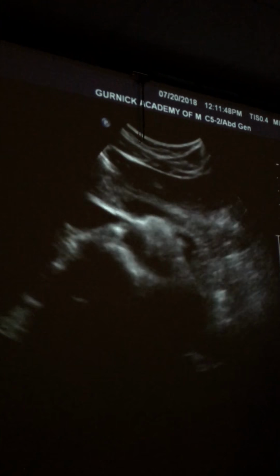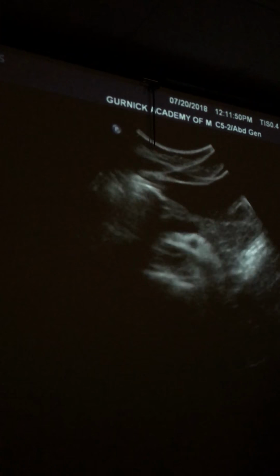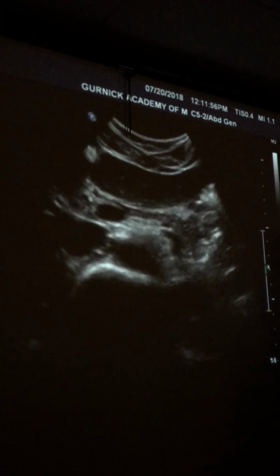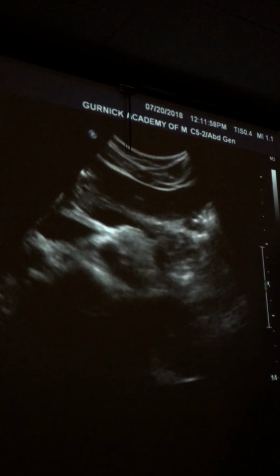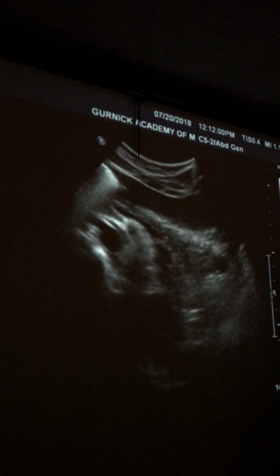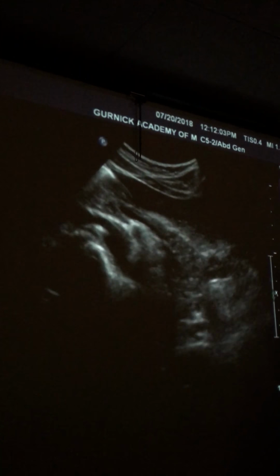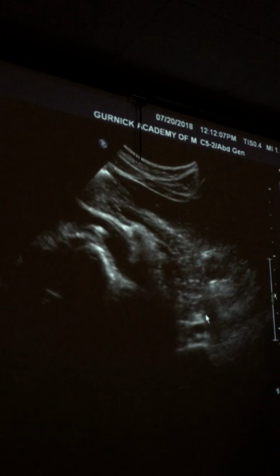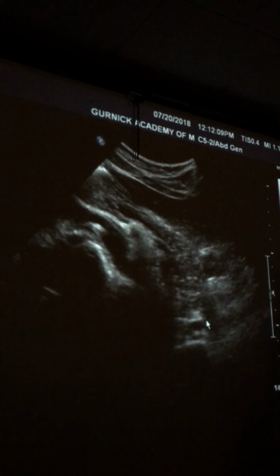I would really like for you guys to kind of show off a little bit and get that tail for me. So, just let me show you something. Like this, we can see the pancreas tail. We can see a little bit of the splenic, but then if I start to angle, look at how much more of it we can see. All of this, right? All of this all the way down.